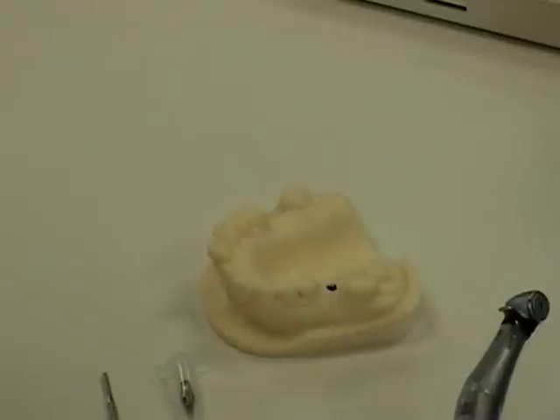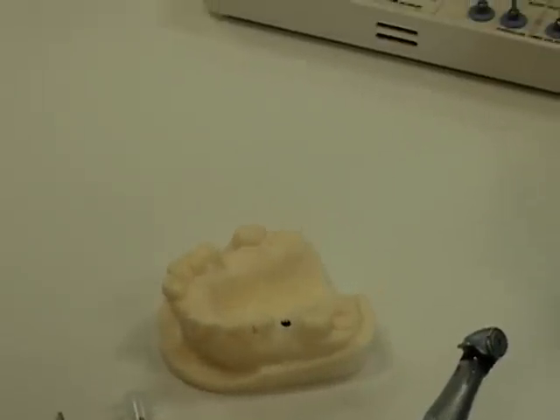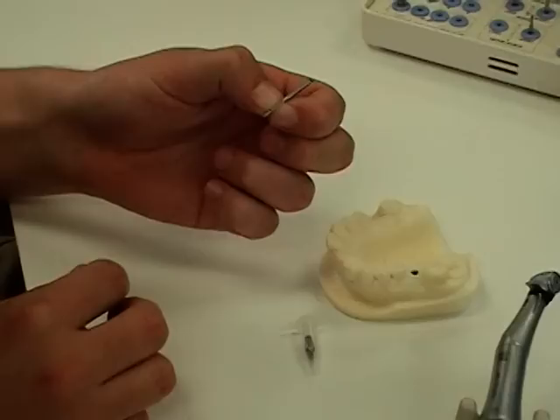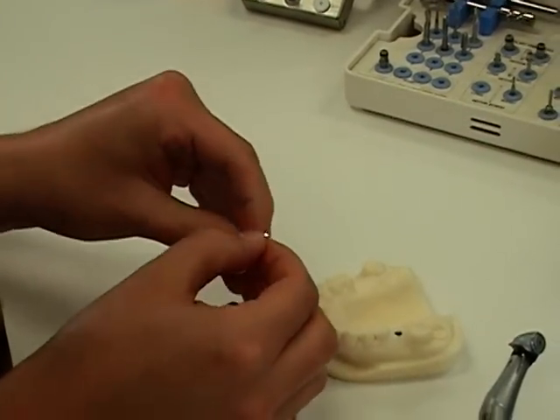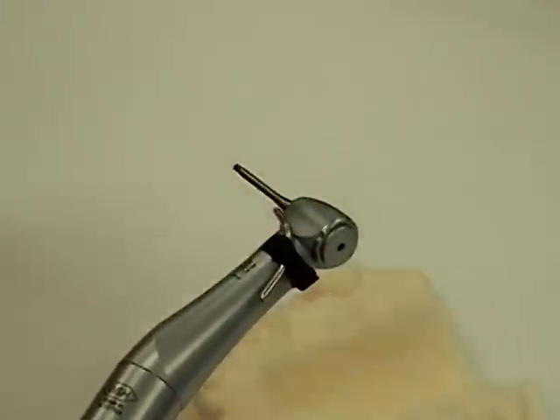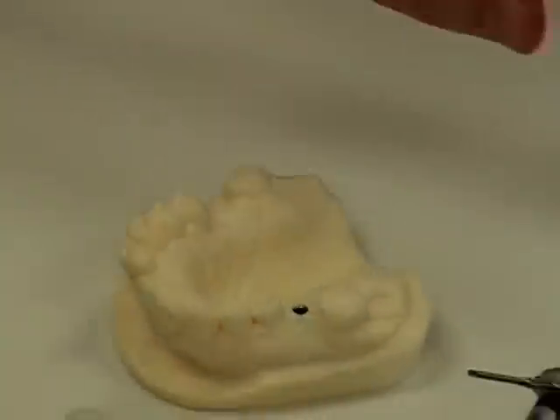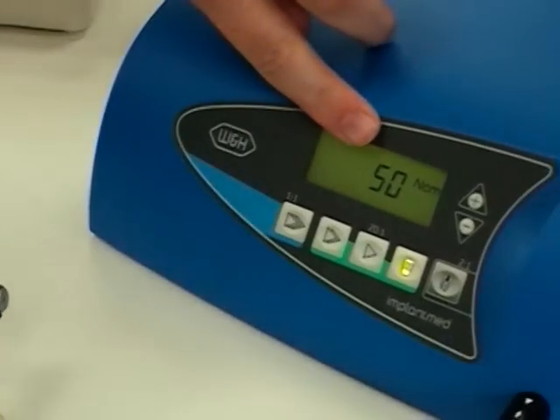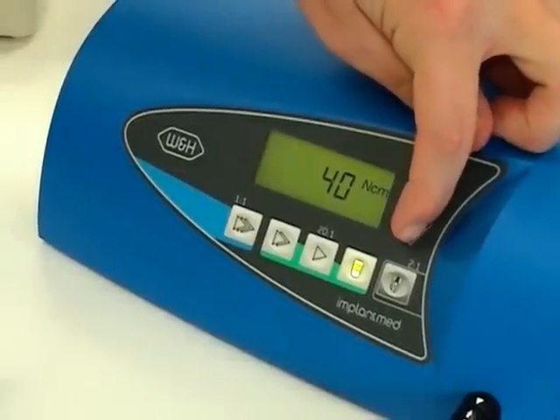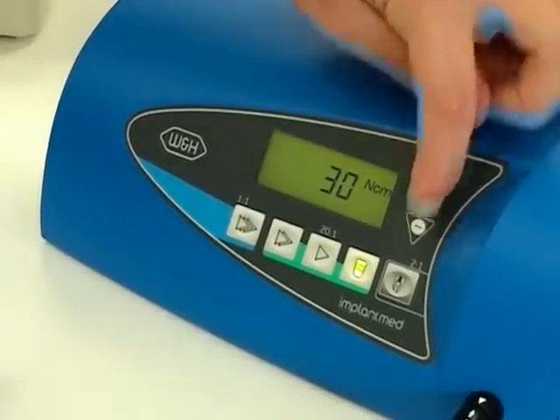The alternate way to torque in an abutment screw is using the handpiece from W&H and a long motor key. This is inserted into here. It's very important to set the motor to the correct newton-centimeter rating that you need, so we're going to lower it to 30 newton-centimeters.